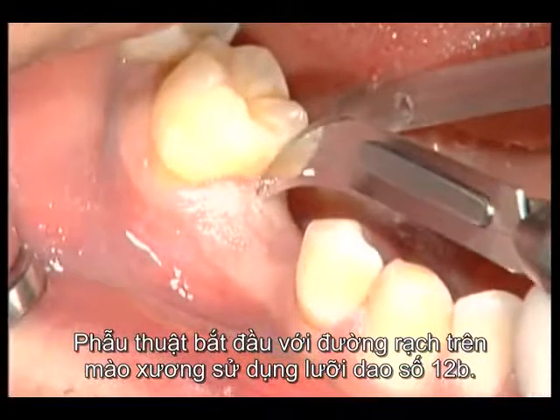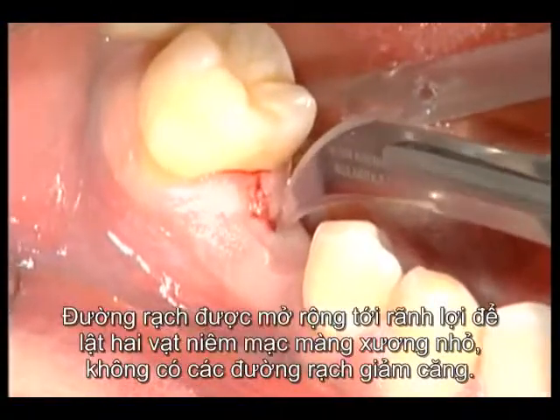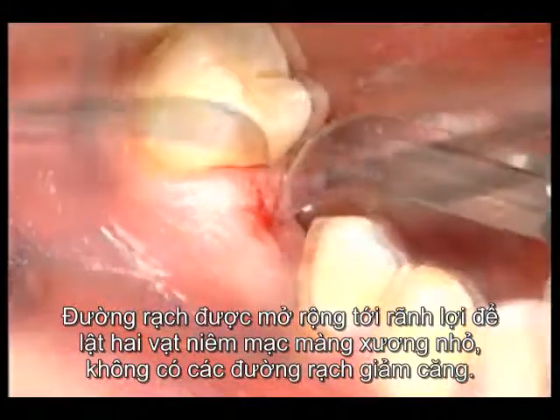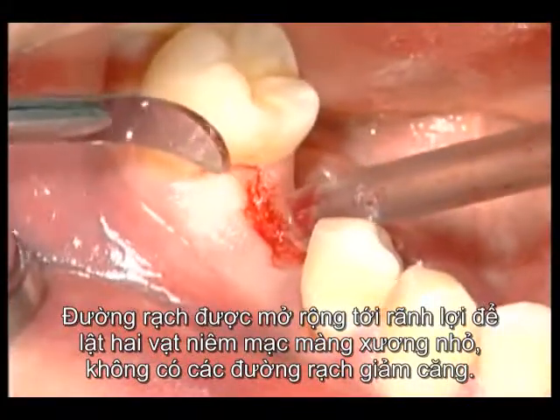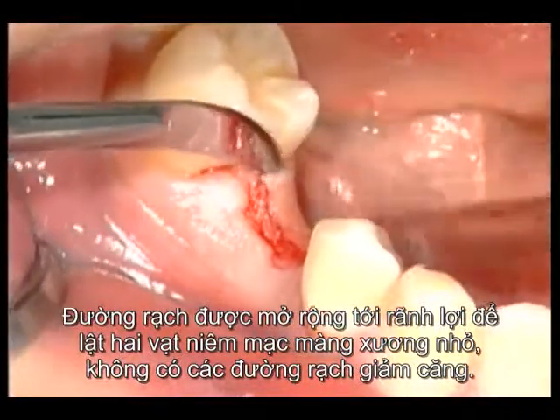The surgery is initiated with a mid-crestal incision utilizing a 12B blade. The incision is extended through the sulcus to elevate 2 small mucoperiosteal flaps without relieving incisions.